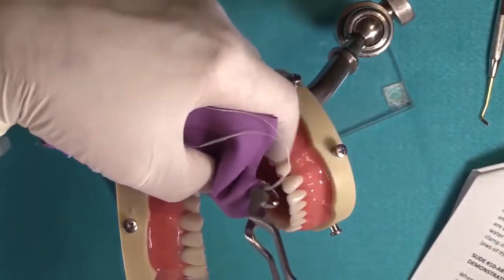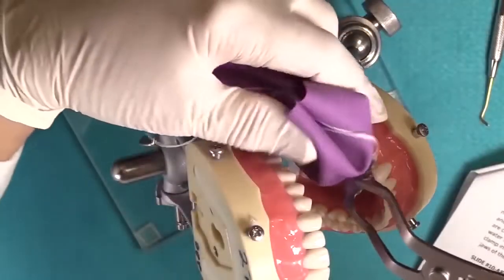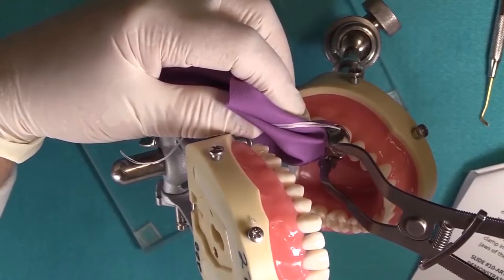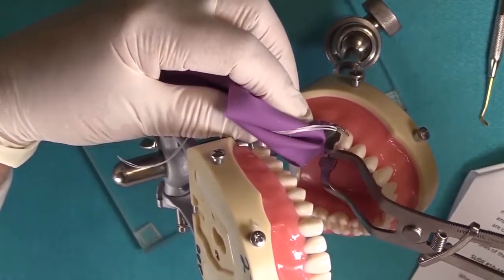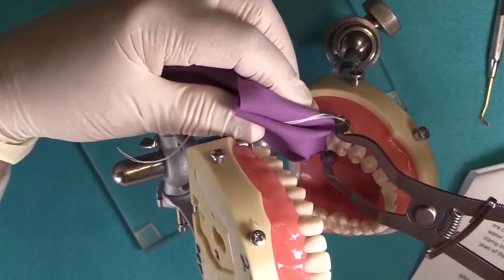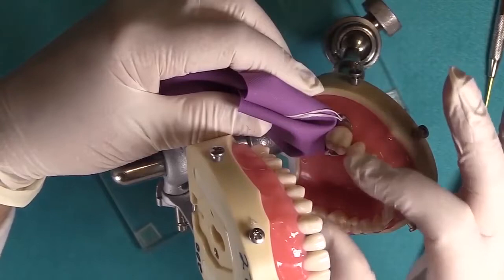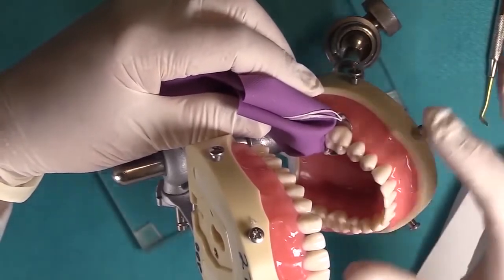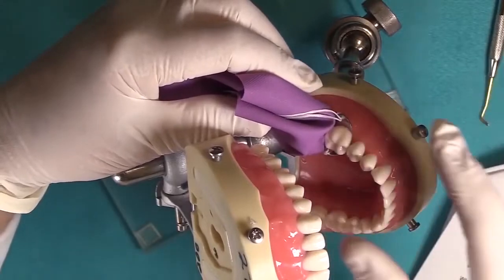So normally you would get your patient's cheek out of the way using your index finger, and then we're coming in parallel to the occlusal surface. Notice I'm using the tooth structure gently to guide the clamp into position. You see what I'm doing here? It's a very controlled motion. The tooth surface is guiding the clamp into position. So just kind of opening it up slowly as you feel it go around the height of contour.